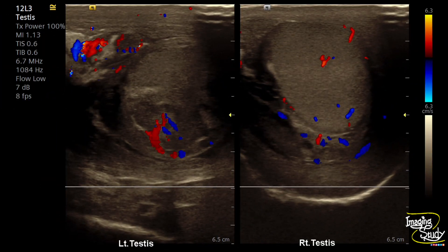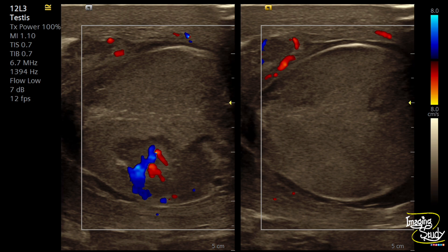The necrosed areas with increased peritesticular flow go in favor of late sub-acute variety of testicular torsion. The right testis shows regular normal vascularity, and with the same settings you can see increased flow within the spermatic cord and prominent flow within the necrosed area. The peripheral prominent vascularity and increased vascularity within the necrosed area are noted, but there is no flow within the rest of the testicular parenchyma. This necrosed area is getting supply from collateral vessels.